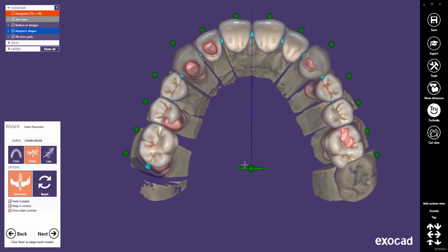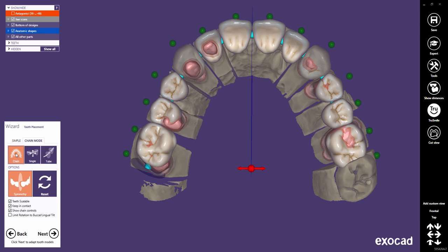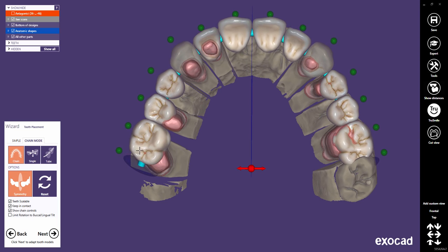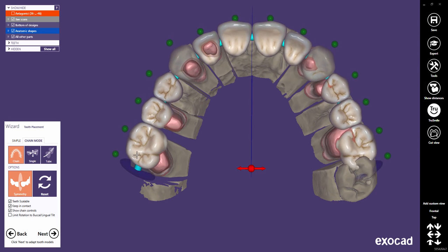We lock the symmetry plane. In single mode, as well as in chain mode, all transformations and control point changes will be mirrored to the other side.